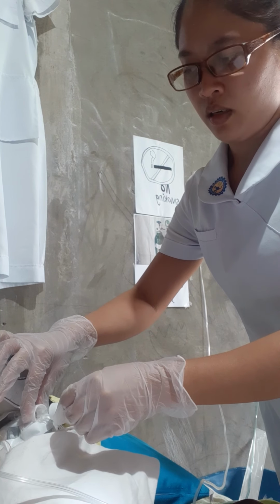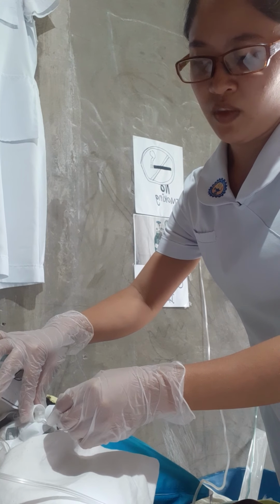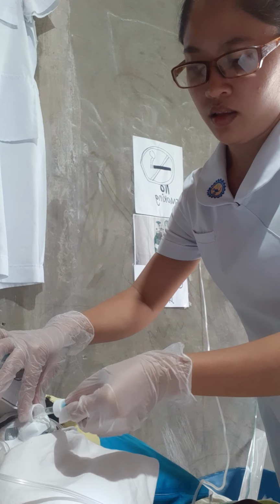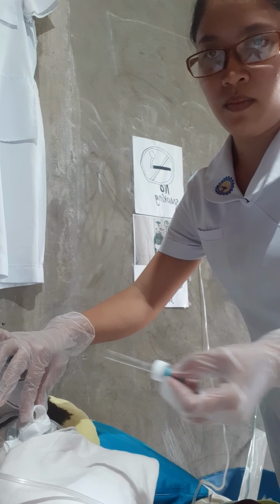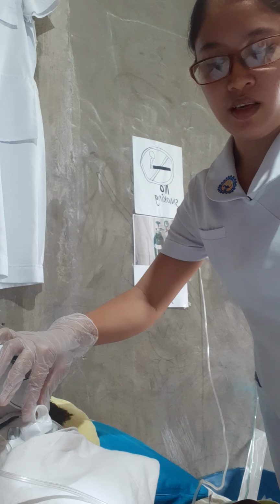Then the non-dominant hand should be holding the faceplate. Then we need to drop this one carefully in the basin.